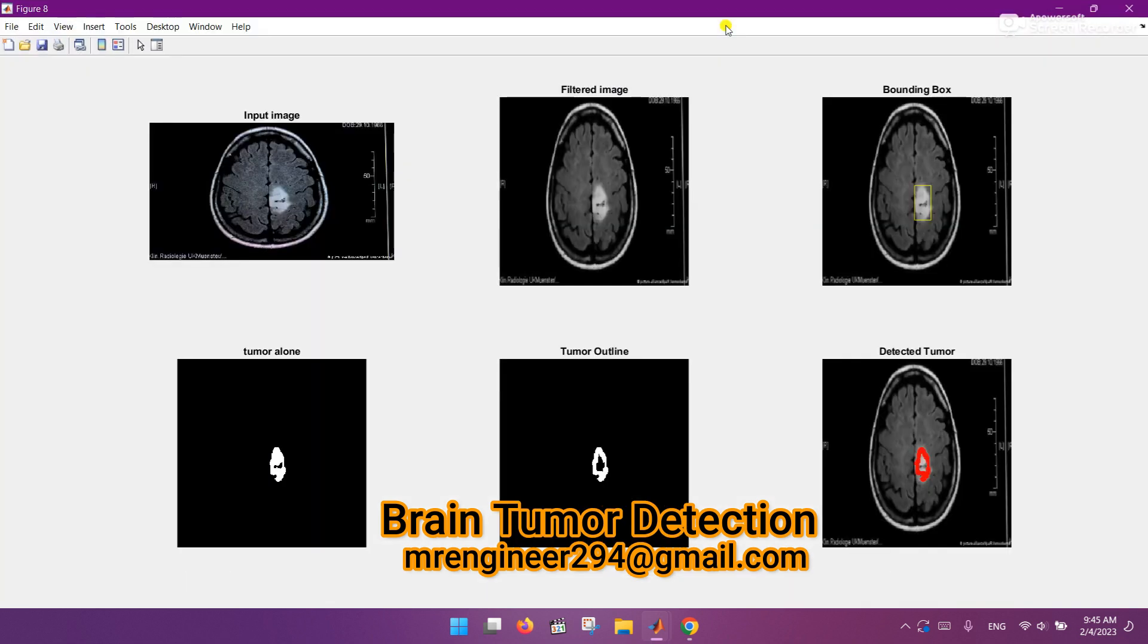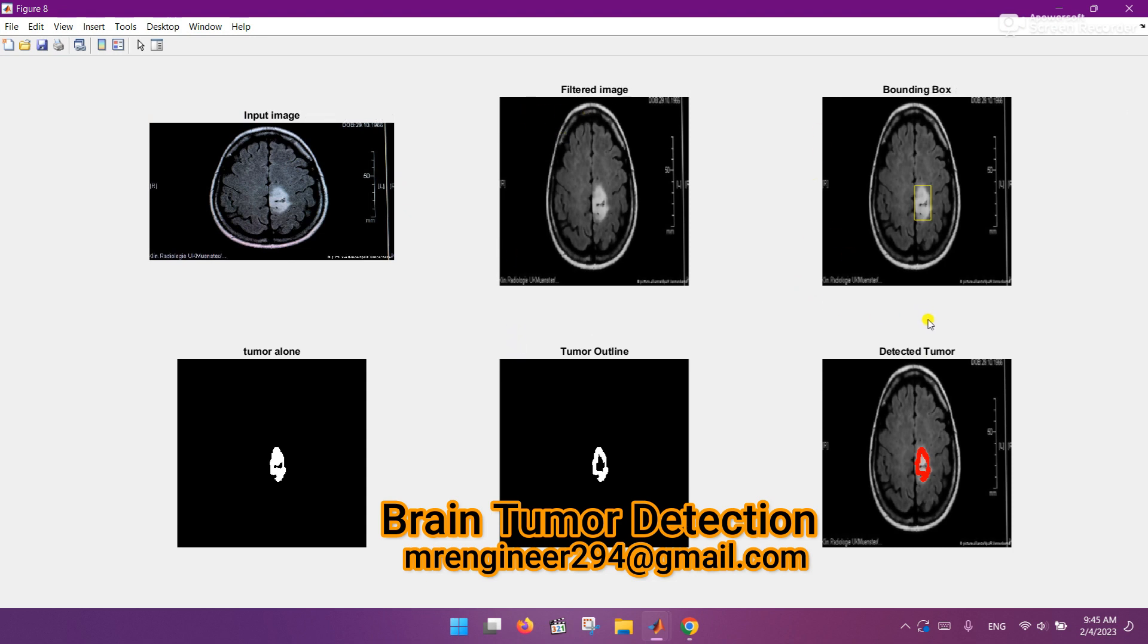And here is the final result. In the first portion, the input image. The second portion is the filtered image. The third portion is the bounding box around the tumor. You can see that around the infected region in the brain.